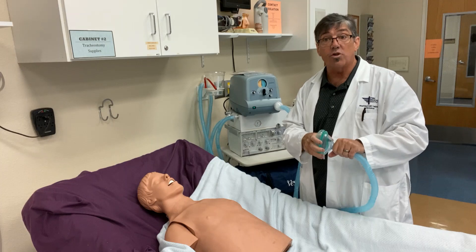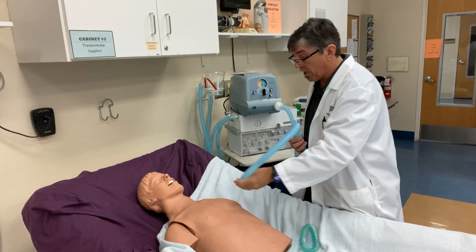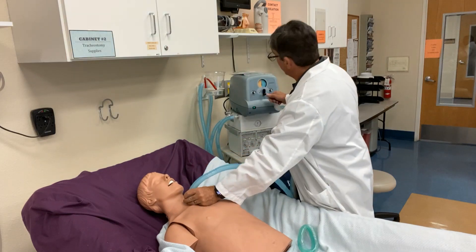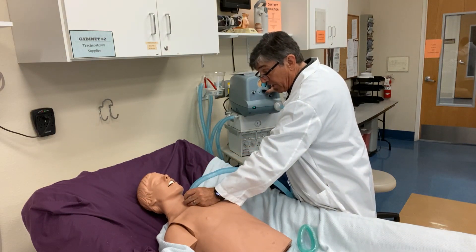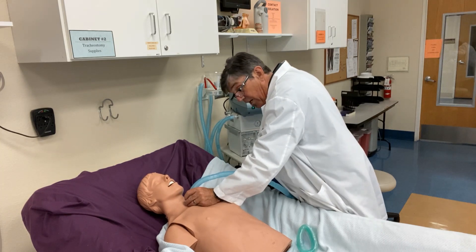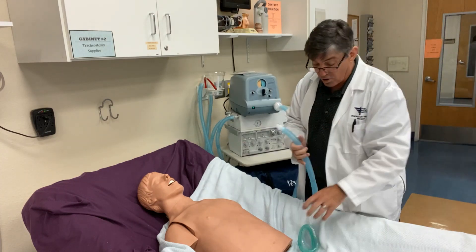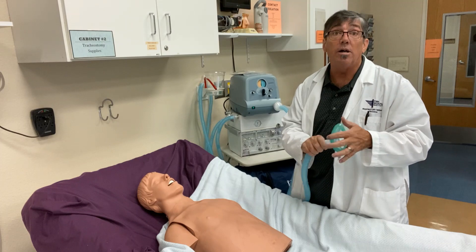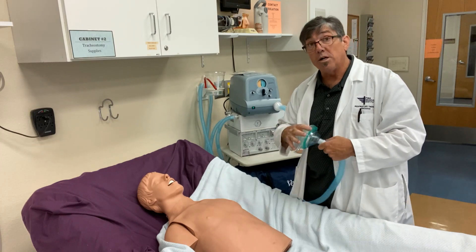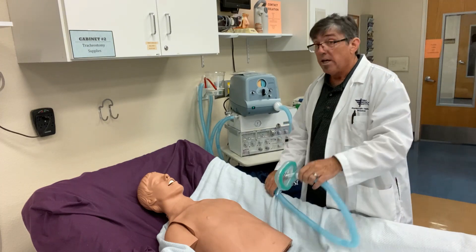You know you're beginning to move some secretions. If you have an artificial airway, we can connect that to the trach and follow the same maneuvers. Have the patient take a big deep breath in, and then flip the toggle to exhalation. The vacuum will occur, drawing secretions outward. Generally it will have the patient spontaneously cough — it will trigger that spontaneous cough at the same time.